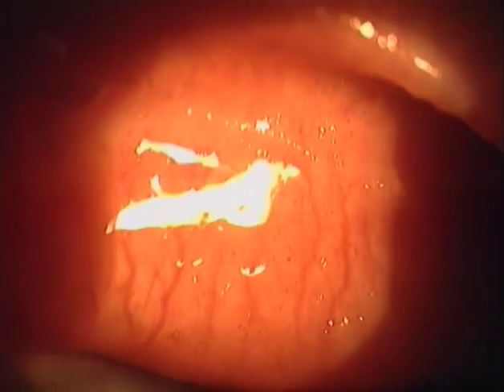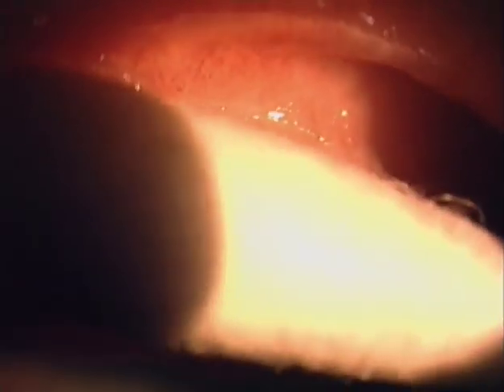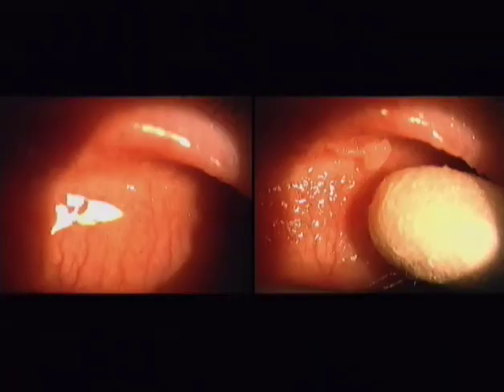Another valuable indirect sign is the presence of an even surface reflex, which indicates the surface to be flat, although based on the papillary pattern of the vessels, we would expect a polyglobular surface. Such a surface actually exists, as shown by the polyglobular reflex, which indeed appears after removal of the covering layer. Compare the two situations again.